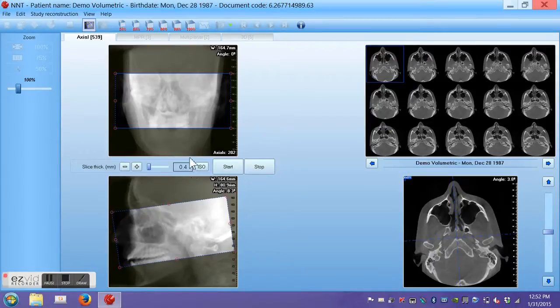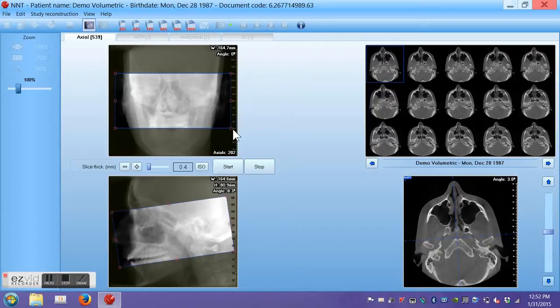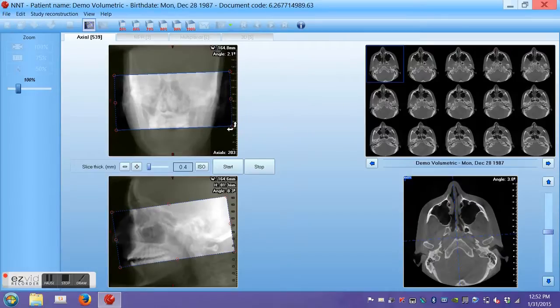Next, I am going to look at the upper image, which is the coronal plane, and make sure that this is also parallel to the occlusal plane. This is pretty good. I am going to make a small adjustment here.